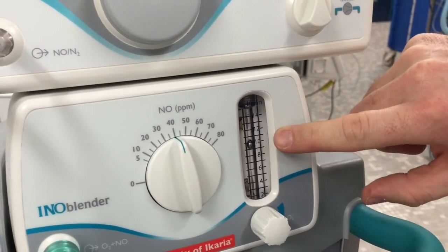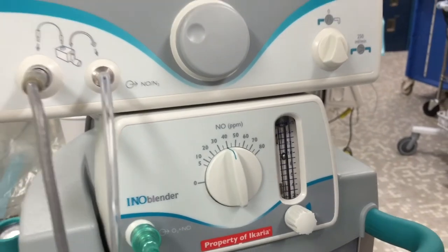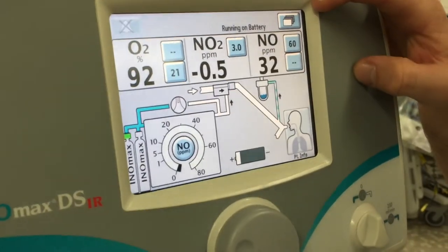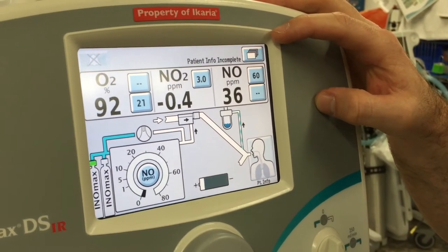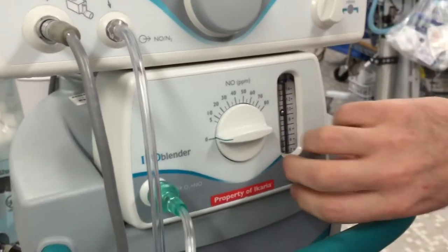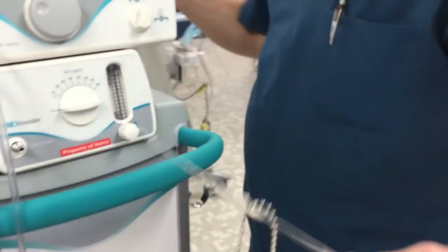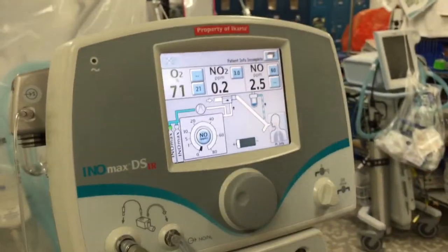The 10 liters is just an oxygen flow, and we're dosing at 40 parts per million. We're waiting for the numbers to come up, but it's very quick. The acceptable range for this test is 32 to 48 parts per million, and we're already at 36. Once you reach that, turn everything off — turn off dosing first, then turn off flow, disconnect the O2 tubing, and put it back on the e-cylinder.